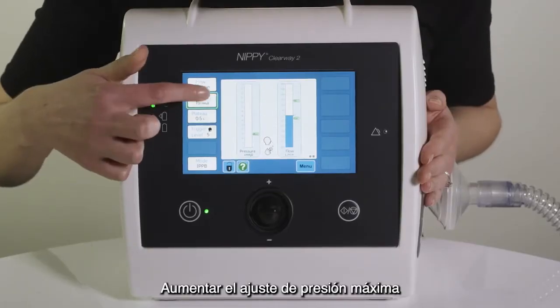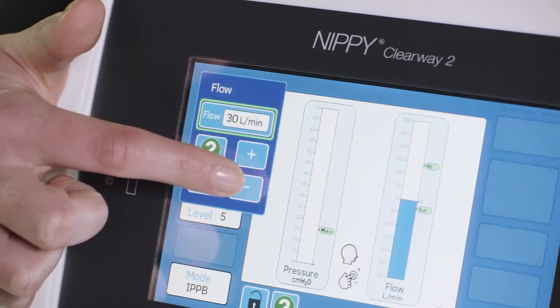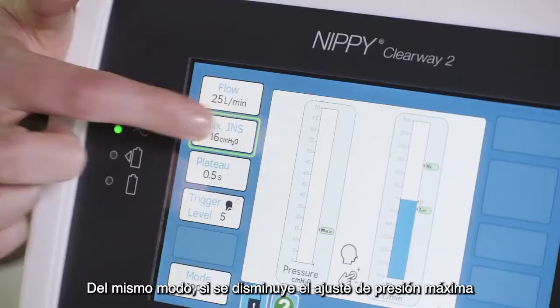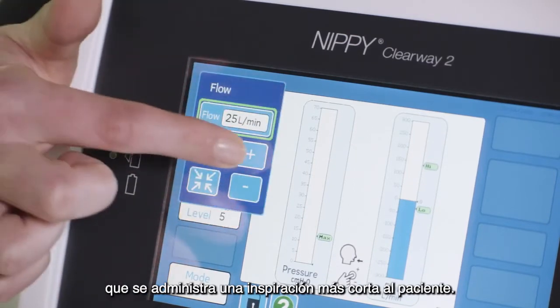Increasing the maximum pressure setting or decreasing the flow setting will mean a longer breath is delivered to the patient. Similarly, decreasing the maximum pressure setting or increasing the flow setting will mean a shorter breath is delivered to the patient.